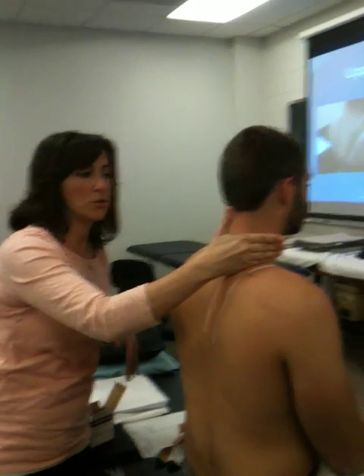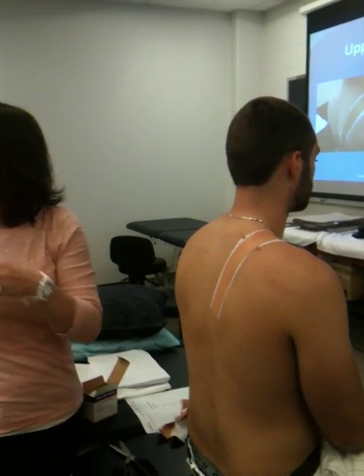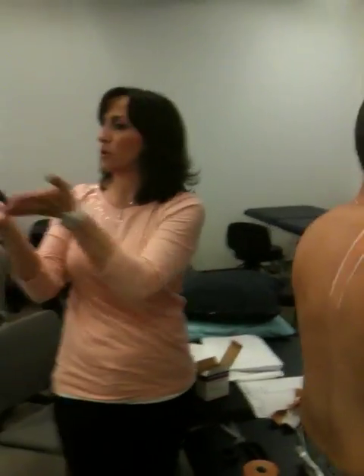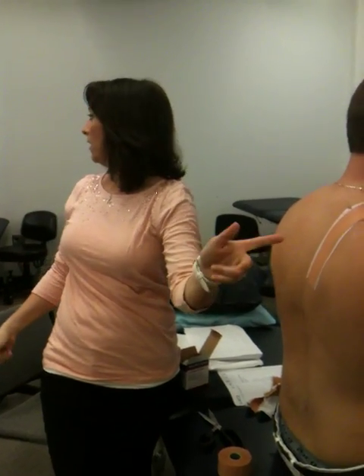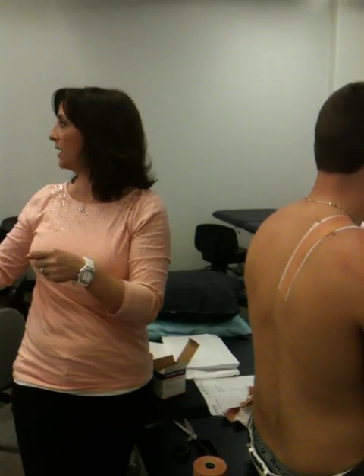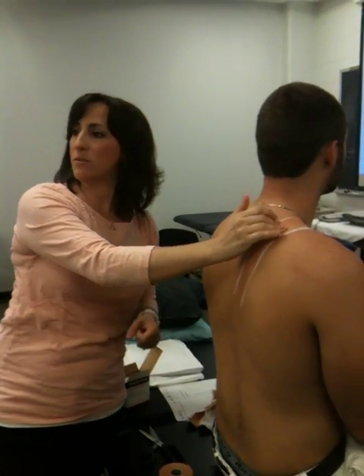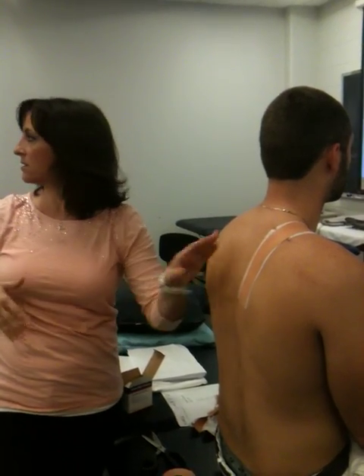By putting pressure through the muscle belly, that muscle now cannot fire the same way. Remember the buckles I showed you, how you put the two pieces together and then you crank and pull it down? Same idea. Because I pull over onto the belly or the tendon, it's not going to be able to fire as well. So this muscle will relax as this tape is on.